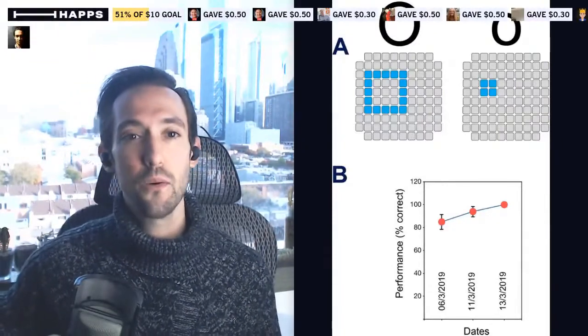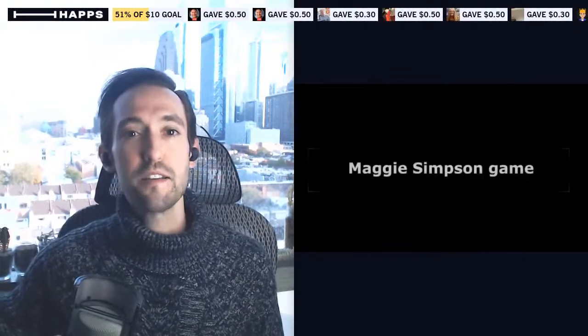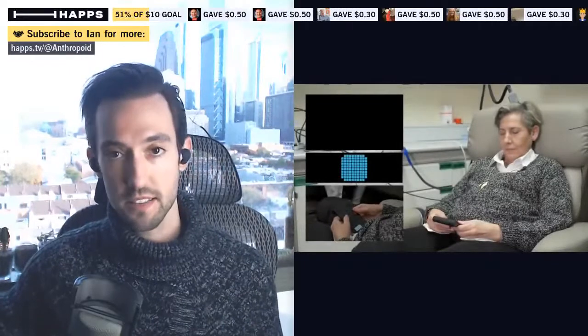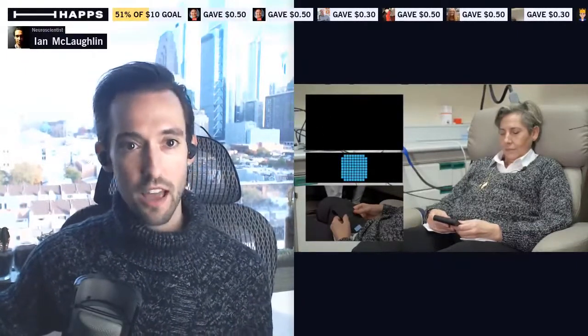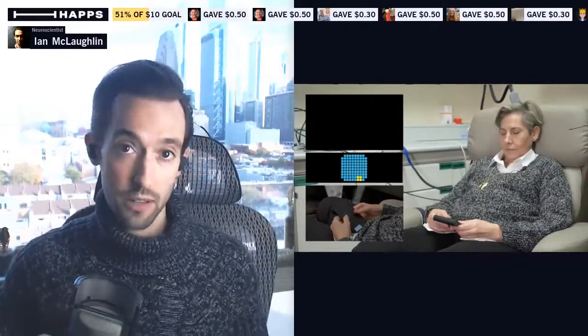That's pretty awesome. And so they did a kind of real-time test, and this is pretty fun, to see how effectively Bernadetta was able to discriminate between stimulation on the right side of the implant and on the left side. Here we go. Okay. Fundamentally, what you're going to be seeing is Bernadetta sitting down with her eyes closed while she's plugged into the system. You're seeing a black box on top, right? And then Maggie Simpson from the TV show The Simpsons periodically appears and fires a shot at the camera, let's say, or at you, right? And she's either using her right hand or her left hand to do it.